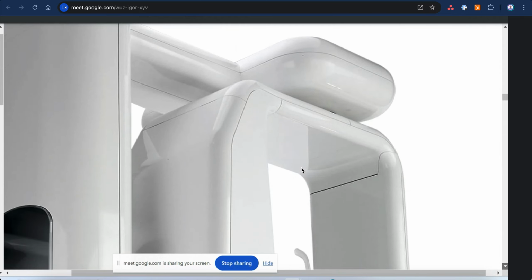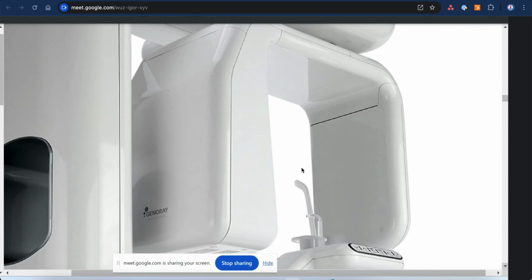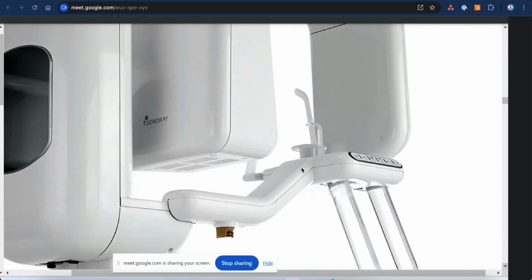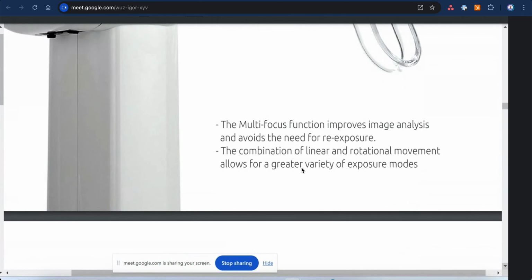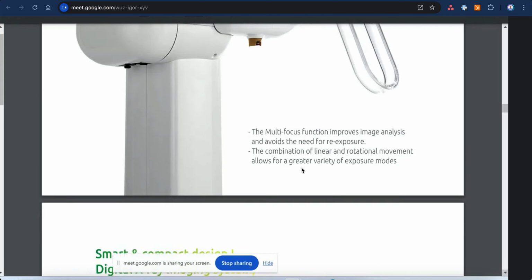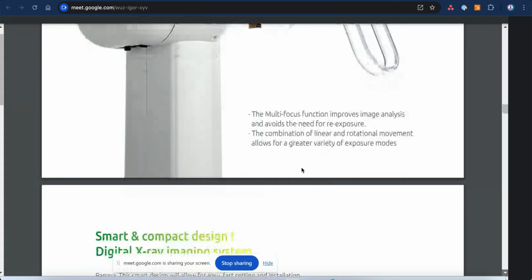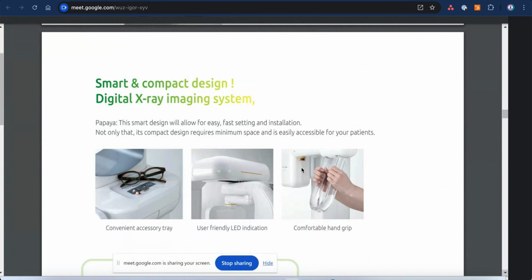Okay, the word plus here means that there's something more other than the panoramic, which is here the cephalometric. Just to explain to the gentleman, sometimes dentists call it different things. They call it a KEF or a CEF. If you hear that, it's a cephalometric, and that's really the arm at the end of the machine. Its purpose is that it takes an X-ray of the whole head. The reason they need the whole head, as Dr. Haya just mentioned, is because they need to see the relationship between teeth and head to do the orthodontic work. Yes, exactly.